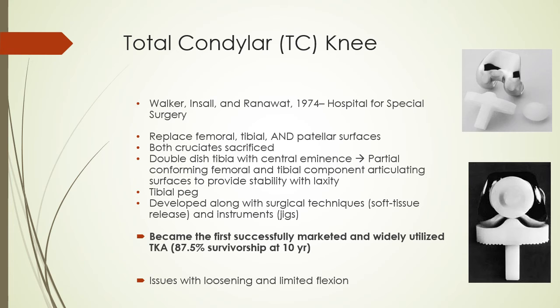The tibial base plate has a peg for fixation, and this design was developed along with surgical techniques such as soft tissue release techniques and instruments such as jigs. The Total Condylar knee became the first successfully marketed and widely used TKA design, with 10-year survivorship above 87%. However, this knee still had some issues such as loosening and limited flexion. As you can see from the features of this design, this is a functional approach design.